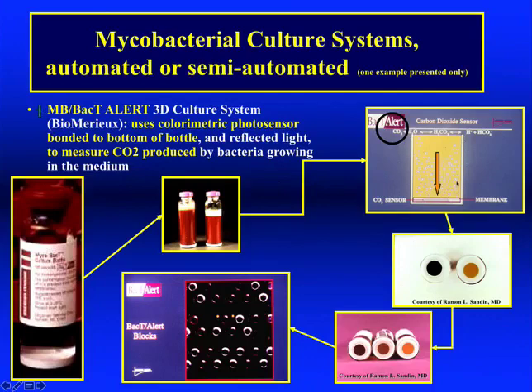So there's going to be the food of the bacterium in the broth, right? The bacterium is there, one of the mycobacteria. It's going to be using it and producing CO2, which will then go through the sensor, and it's a CO2 sensor. It will change the color from an original, say, dark greenish, to an orangish and then yellow. So dark greenish permutations of orange to a light orange yellow. And at that point, the instrument will flag itself by a light or an alarm, and the tech pulls the bottle 24 hours a day.